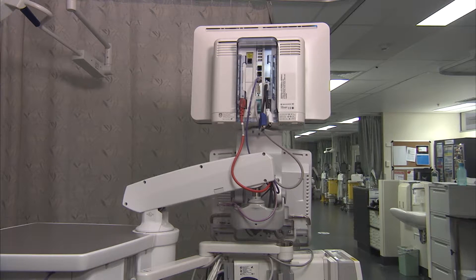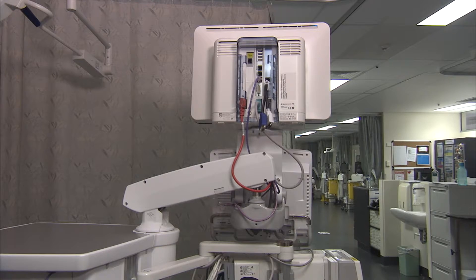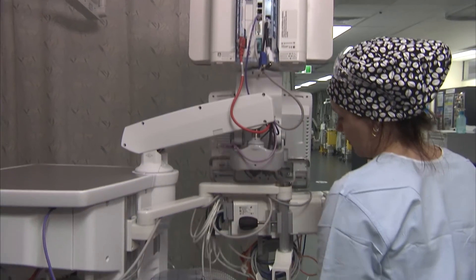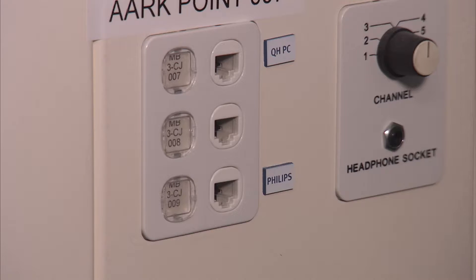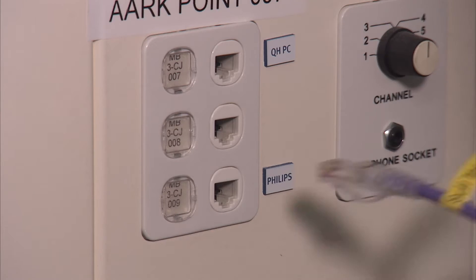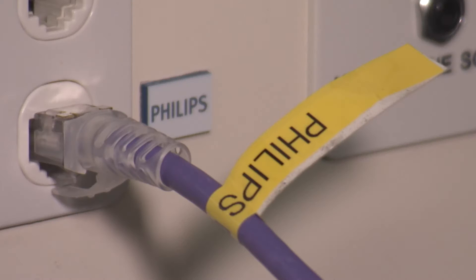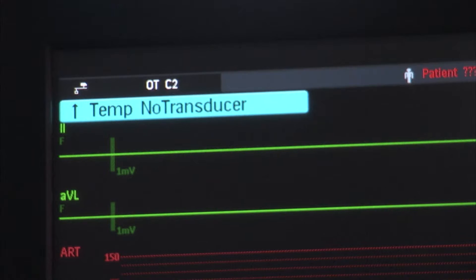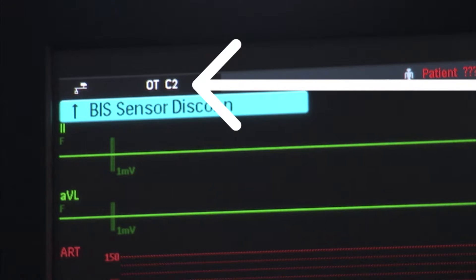Now it's time to connect the Philips MX800 monitors on the anaesthetic machines to the Philips network. This is done by connecting the purple Philips cable from the LAN cable port on the back of the MX800 monitor into the Philips network data point. All Philips network cables and network data points will be labelled with Philips. This is what you should see on the Philips monitor screen if it is successfully connected to the Philips network.